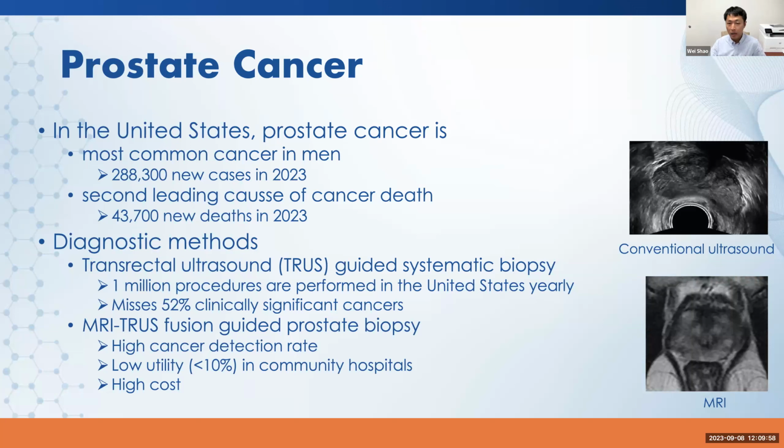Before we do the biopsy, we take an MR scan of the prostate of the patient, and after that we ask our expert urologist to outline regions they found suspicious for cancer lesions. Then we need to map those lesions into the real-time ultrasound, and then we have the second session. So this is one session, right? You ask the patient to come in and have an MR scan.